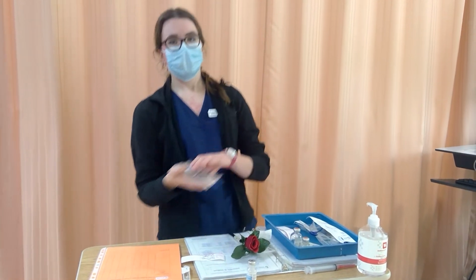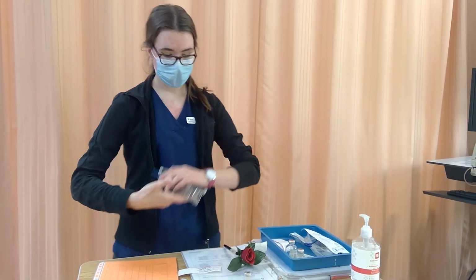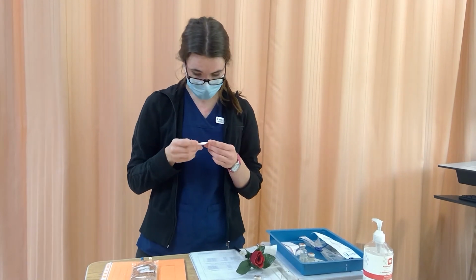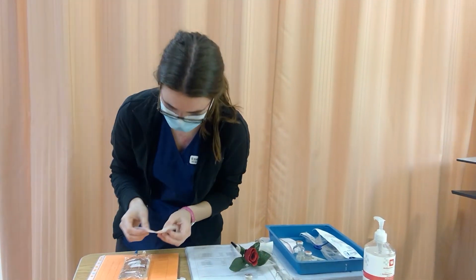Just going to gently mix this and make sure all the medication is nicely spread out. And I'm going to attach my label. So take off the sticker. Oh, come on. Okay.